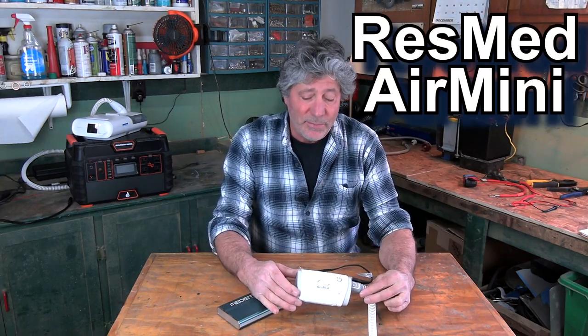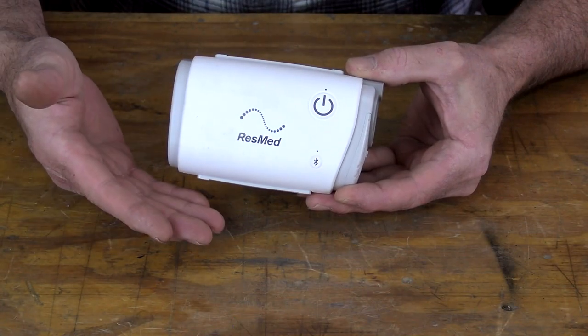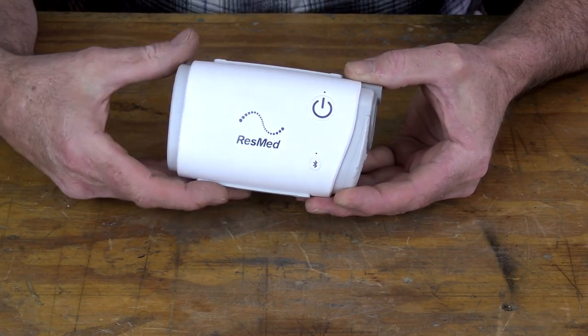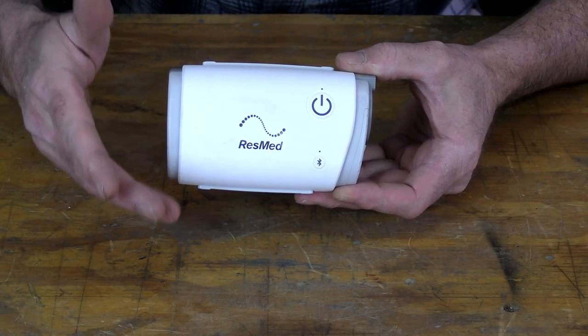This is the ResMed Air Mini from a company called Lofta. It required a prescription from my doctor and is set up to all my requirements. The first thing you probably noticed is its lack of a humidifier water tank — this has a unique way of not needing one, which I'll get to in a minute.